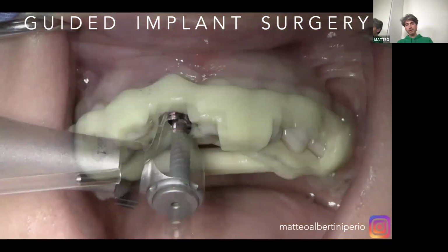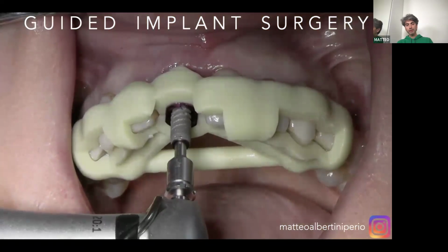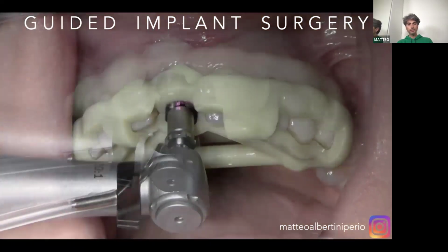As you can see, we are using the sniper system.